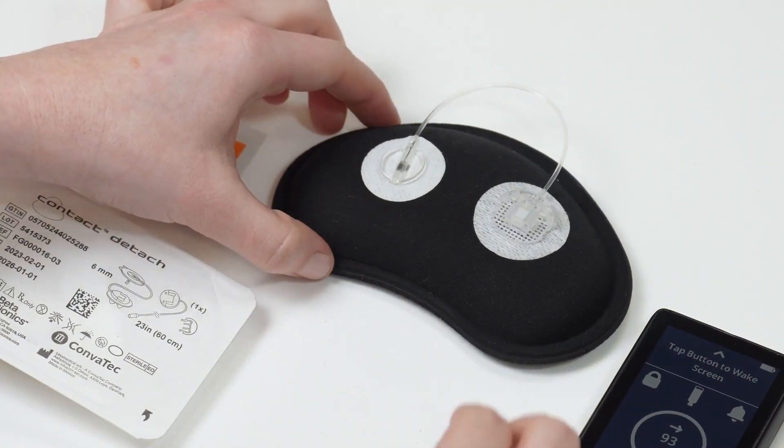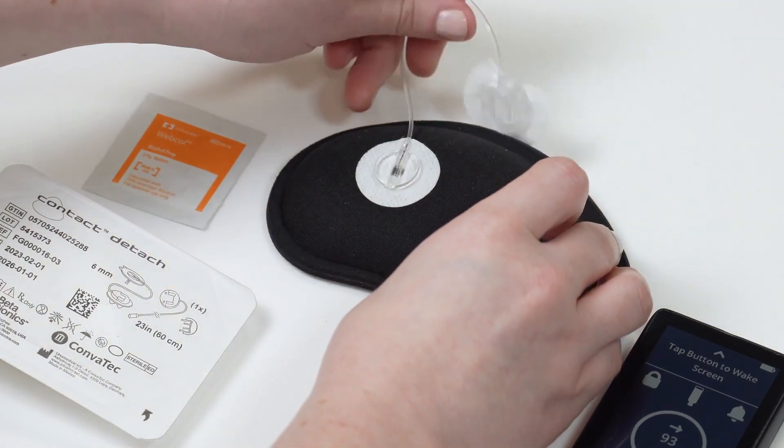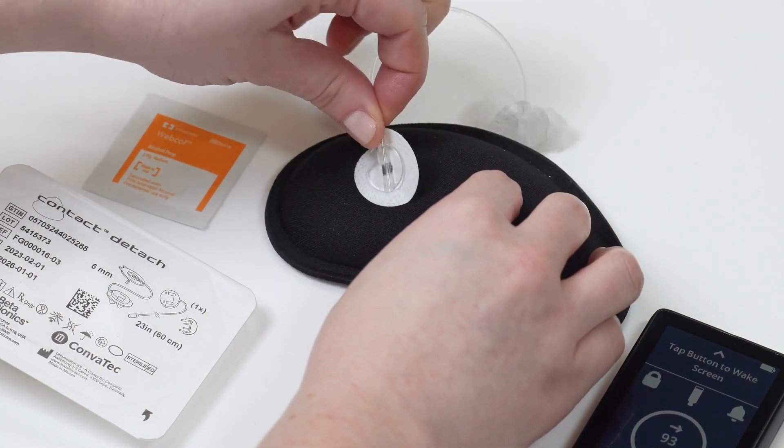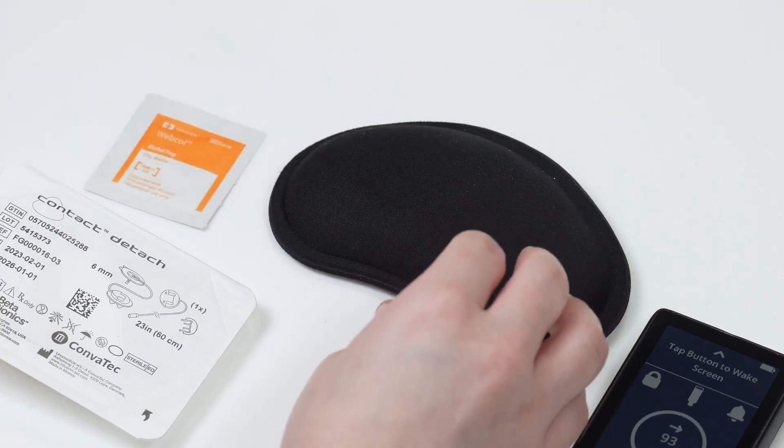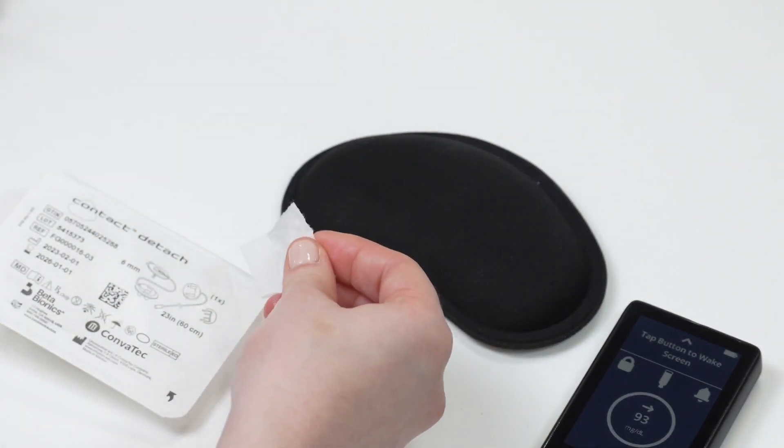First, disconnect your tubing from your infusion set base and gently peel the old infusion set off of your body. Then clean your skin.